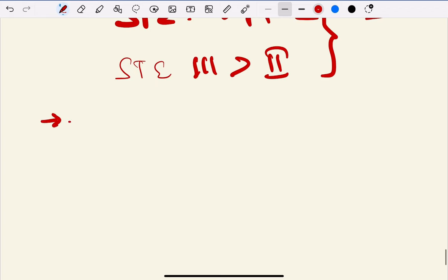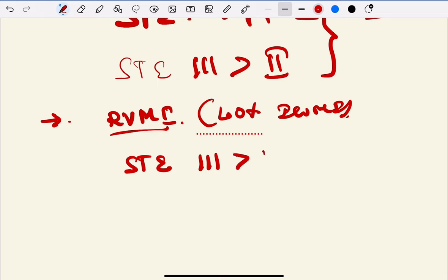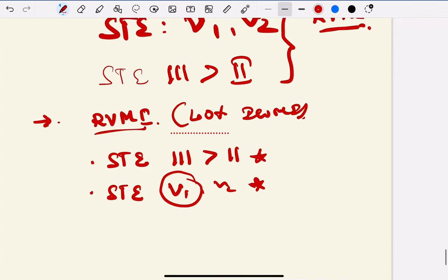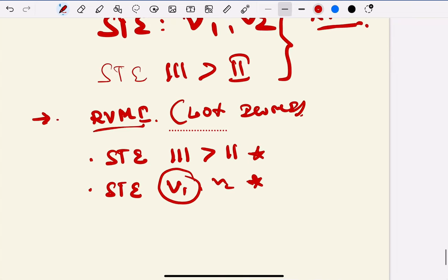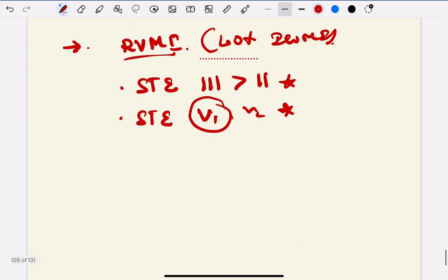The important take-home message from this video is how to identify right ventricular MI. Around 40% of inferior STEMI is complicated by right ventricular involvement. How to identify it? If you see ST elevation in lead III more than lead II - that's one point - and ST elevation in V1 and V2. V1 is more important because V1 is the only lead which directly looks at your right ventricle. These are special star points.